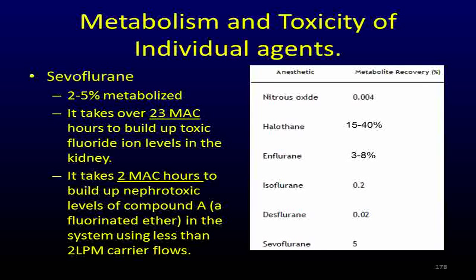It's not going to be rebreathed by the patient. But if you're less than 2 liters per minute, you've now entered a semi-enclosed circuit, so the patient can actually rebreathe these compounds. So if you have to use less than 2 liters per minute, you can only run it for 2 MAC hours.